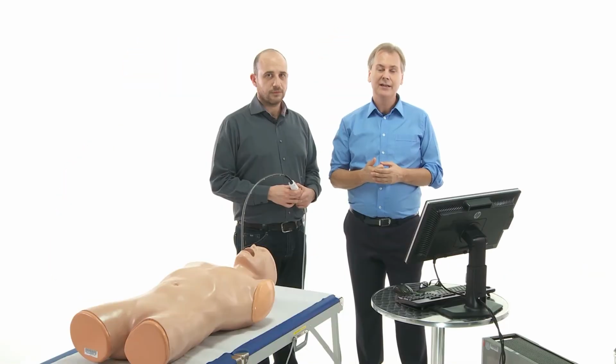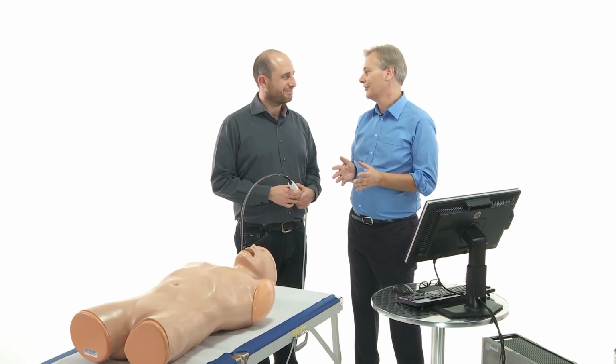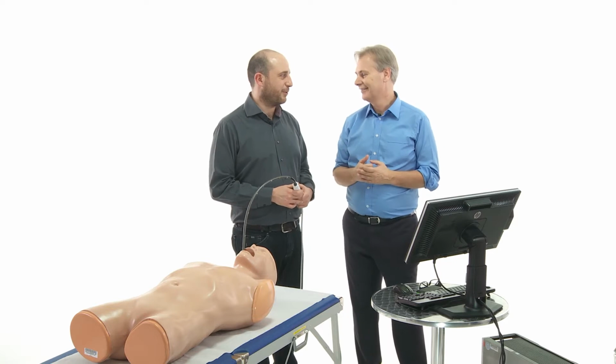For example, in patients who have very poor image quality, or patients on the intensive care unit who are anesthetized or intubated, there you have to use TEE to quantify aortic stenosis. And there is a way of doing it, even though it's very difficult. Bruno, I think you can show us how to do it. Yeah, Thomas, it's no problem.